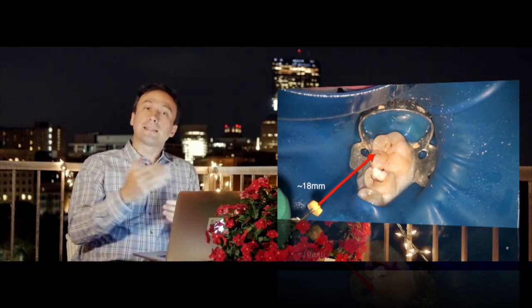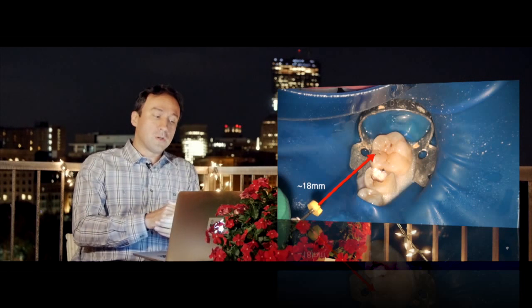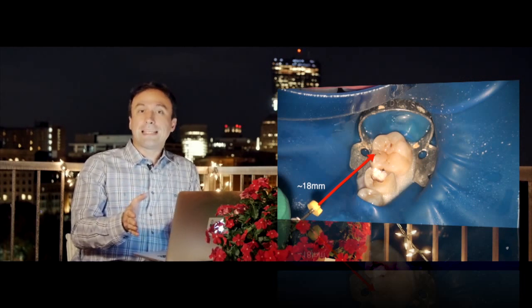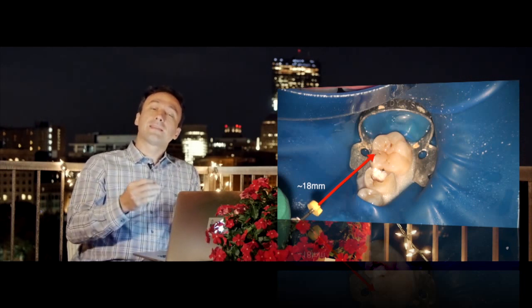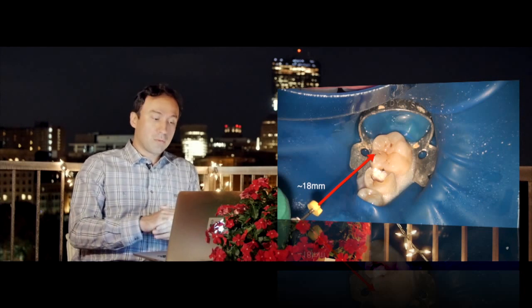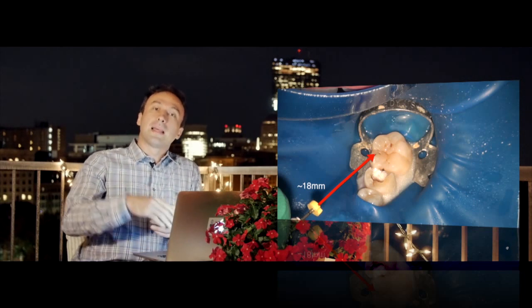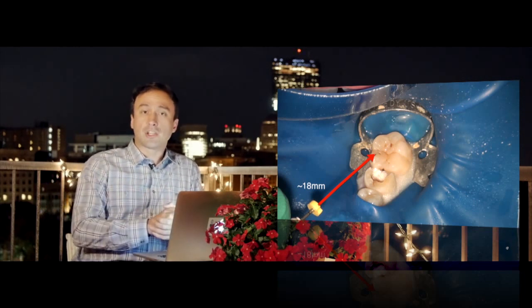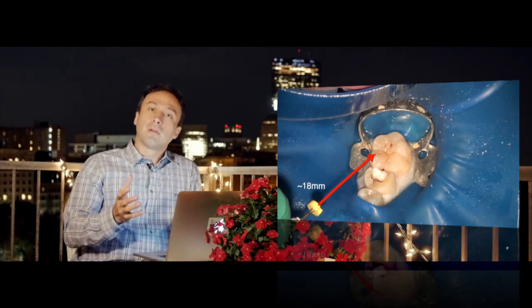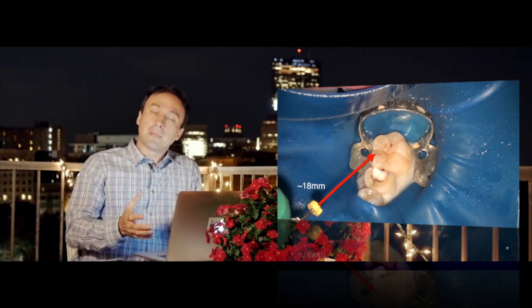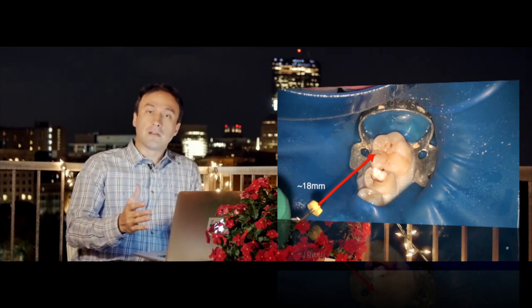In this case, after placing the number 15 hand file into the canal right off the bat, we've been able to push that file down to about 18 millimeters. We make note of that, because we now know that is the canal space that is available. I'd like to coin this term — available length — because it tells me we have an available space of 18 millimeters in this canal that is open to a size 15 right off the bat.